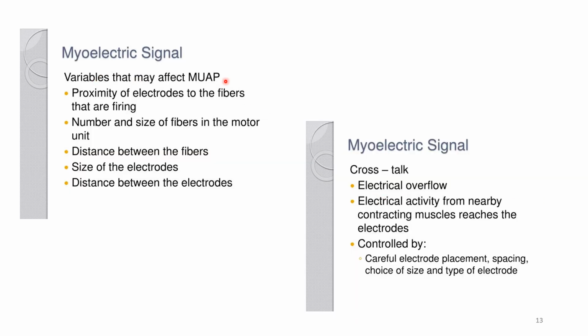Now coming to the myoelectric signal. That is the signal which is generated from the muscle. It is converted into an electric signal.